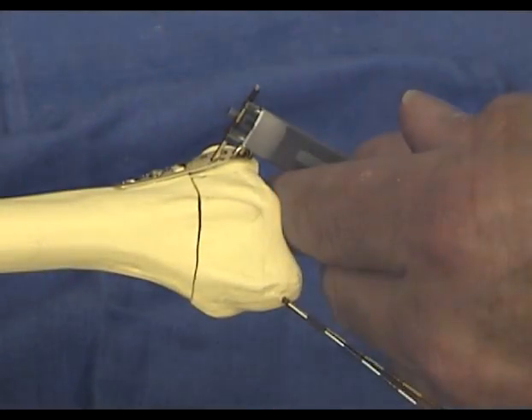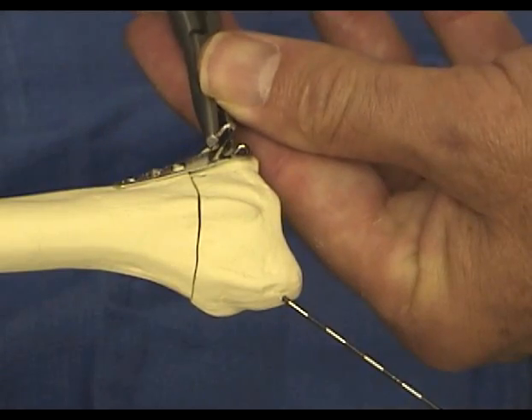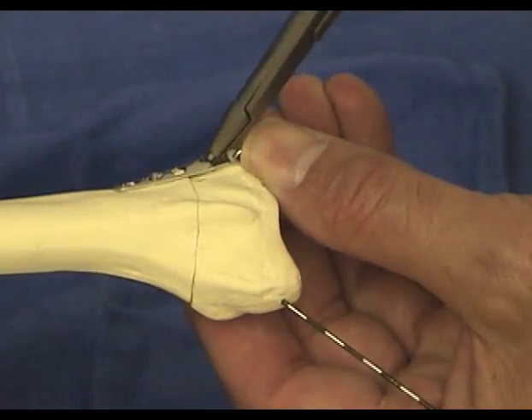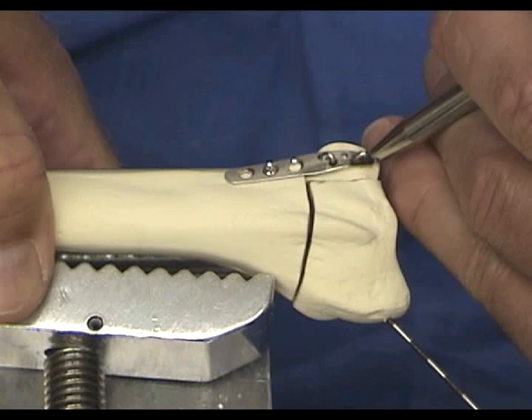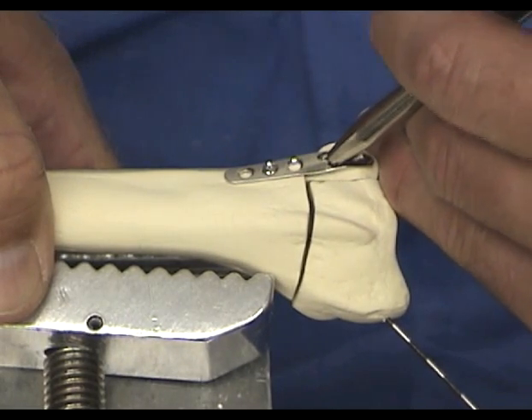It is particularly important to get the correct length to the pins of the ulnar pin plate in order to avoid irritation to the volar structures. This is possible by using the drill sleeve to prevent over-penetration when placing the pin initially and confirming the position on the C-arm. This ensures that the mark locates the pin at the correct depth.